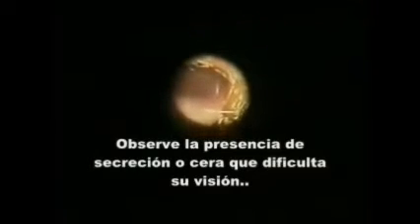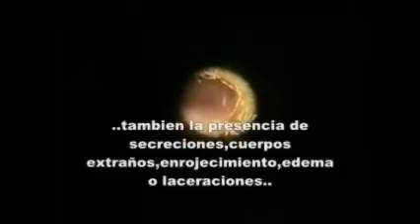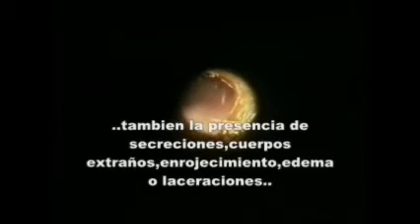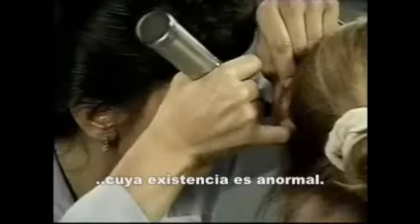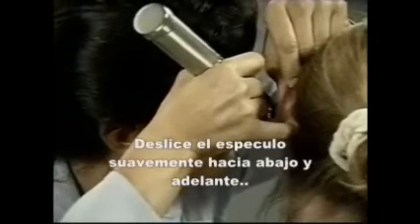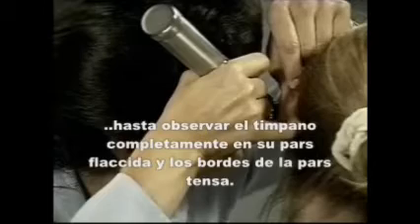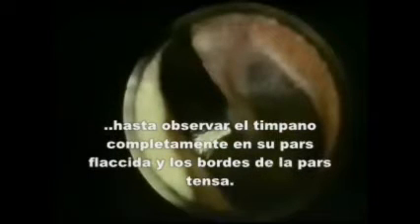Note any cerumen or earwax that may impair your view. Also observe for any discharge, foreign bodies, redness, swelling, or scaling. There should be none. Slide the speculum slightly down and forward and maneuver it until you can see as much of the eardrum as possible, including the pars flaccida if possible, and the margins of the pars tensa.